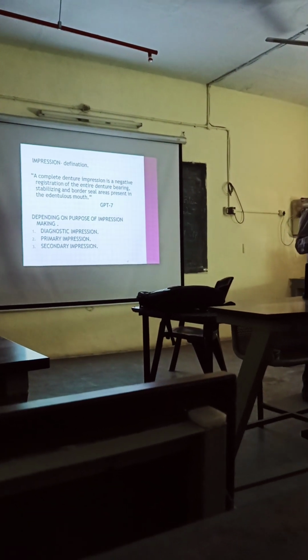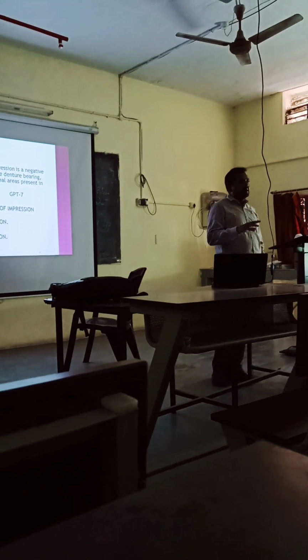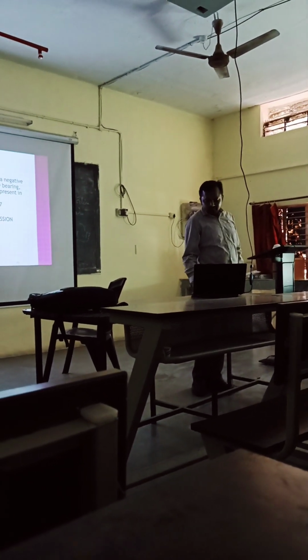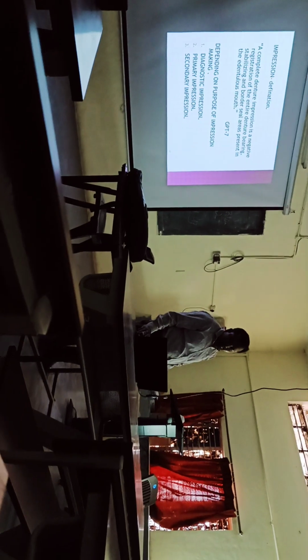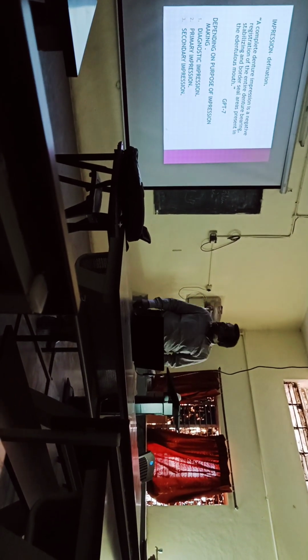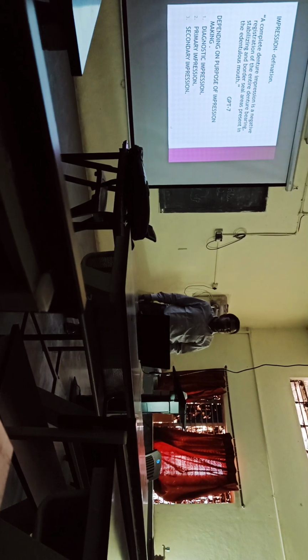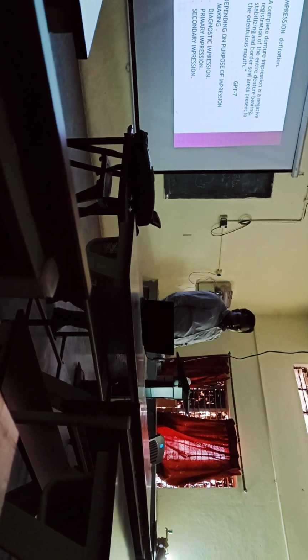Secondary impression means where you will be covering with even border molding also. Border molding, then making the secondary impression. Complete denture impression is a negative registration of the entire denture bearing areas and stabilizing and border seal areas present in the edentulous mouth. This is by GPT-7.